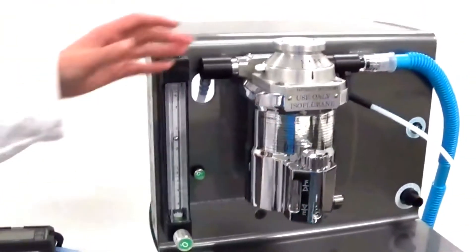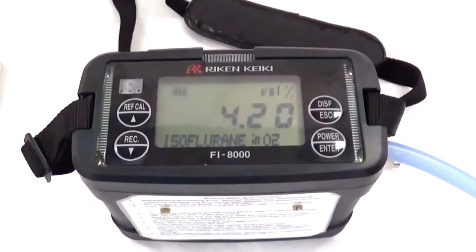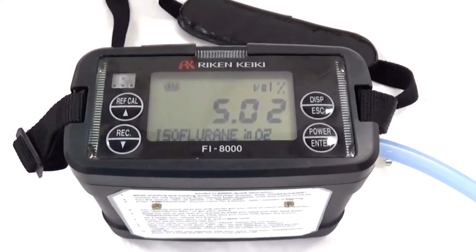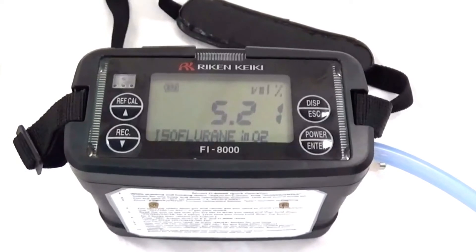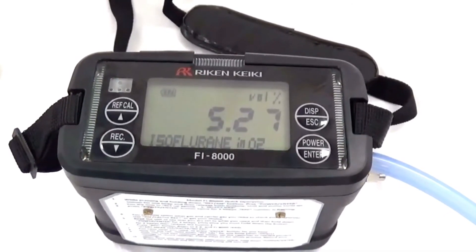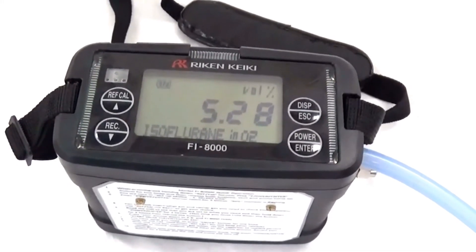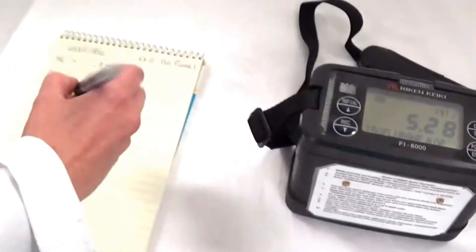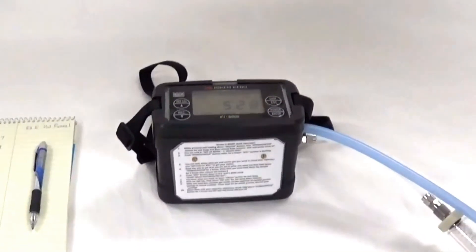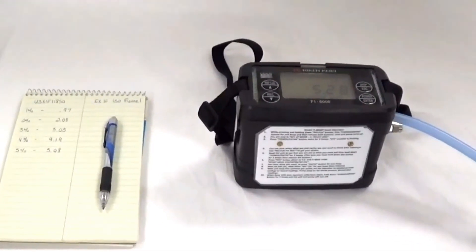And do the last dial setting of 5%. The reading is 5.28%. We will record that setting. This now completes the output verification of this particular vaporizer.